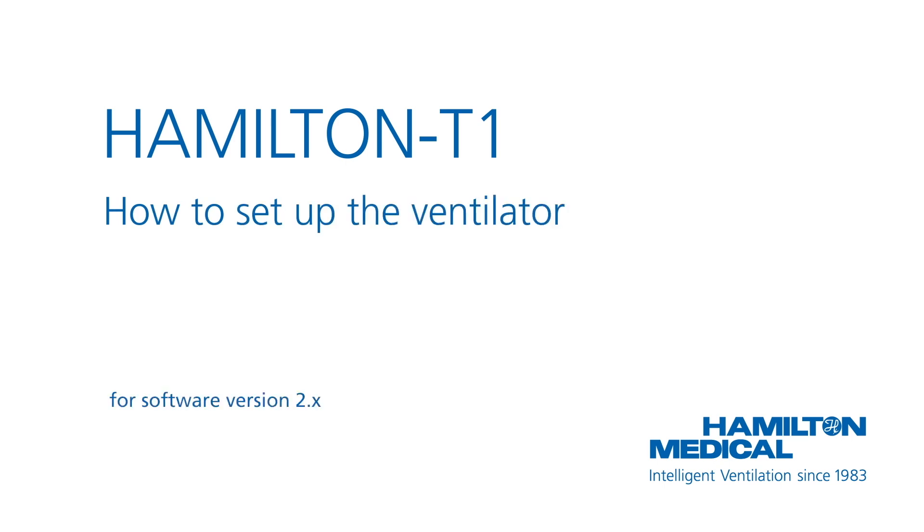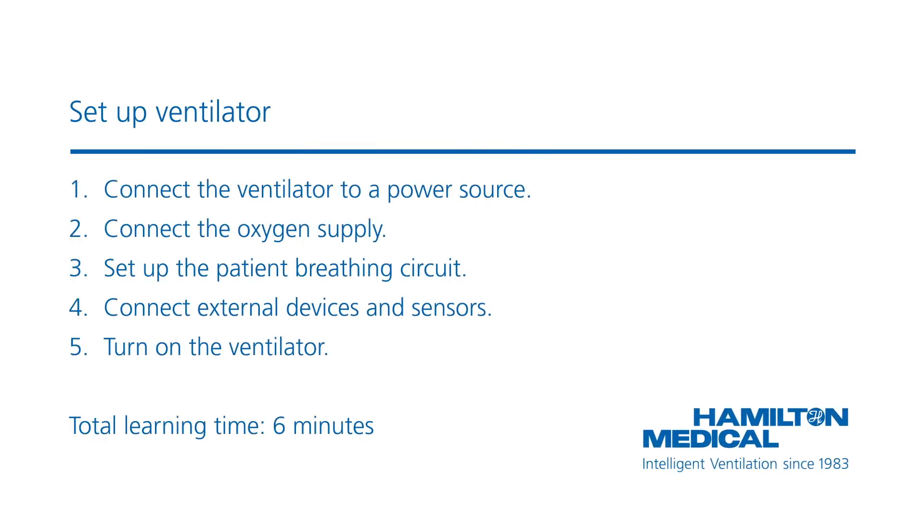This how-to video will show you how to prepare the Hamilton T1 ventilator for use. Although we are using a Hamilton T1 in this video, all the procedures we demonstrate here are the same for Hamilton C1 and Hamilton MR1 ventilators. Before you start ventilation, there are a few things you need to do. You should be able to complete the whole module in less than 6 minutes.